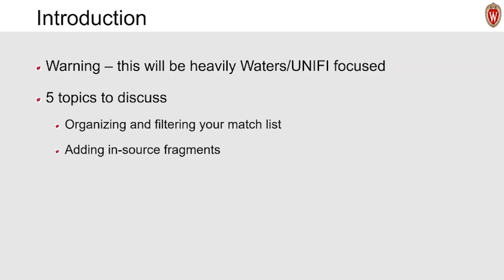Next, have you seen compounds that lose ionization in the middle of a peak because they've saturated the detector? Or maybe there's a compound that's breaking down before it gets to the detector. Let's make extra ways to detect them so we don't miss anything because of high mass error.